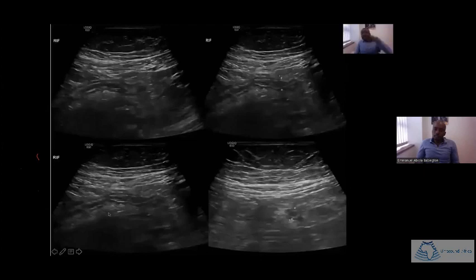We asked them, where is the pain? Here. We placed the probe there, and we saw this. This was done after we had scanned everything else: the liver, kidneys, gallbladder, ovaries, and everything else. So this is the appendix there, and it measured 7 millimeters. It was non-compressible, blind-ending, tubular, and in transverse you get the target appearance, and you can see it there.